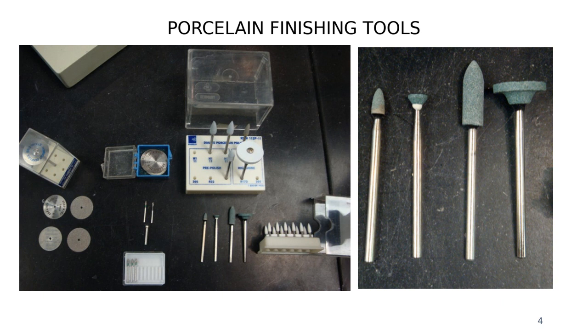So we can see here, especially those green stones, we have different shapes, right? To help us. This big one, we can use for cutting, let's say the sprue and bulk reduction, right? This we can use to contour more on the cusps, right?